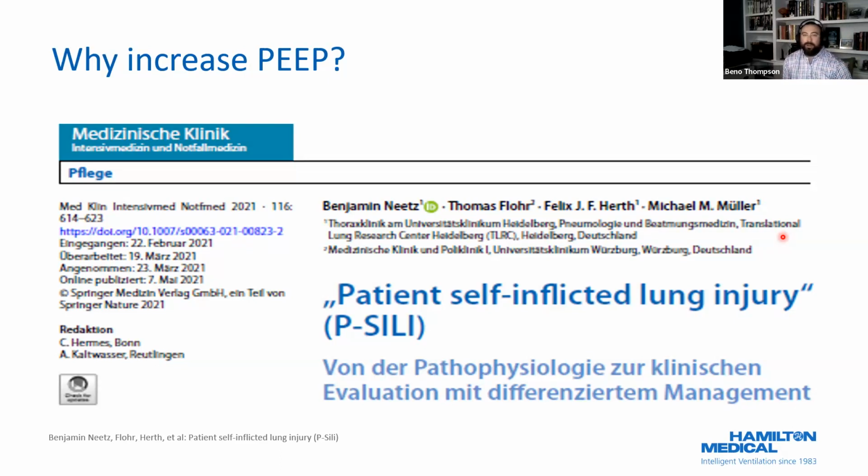That's why they had such horrific work of breathing, because they were actually too far away from their optimal FRC or their optimal PEEP. So next time you see one of those patients and your colleague says, "God, I just can't capture this guy. I keep going up on the pressure support. He's still just sucking pond water." Well, go up on the PEEP, see if that works.